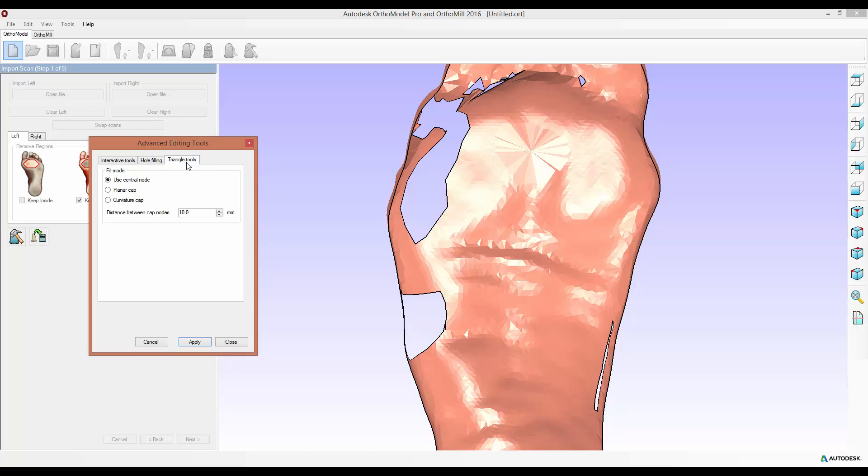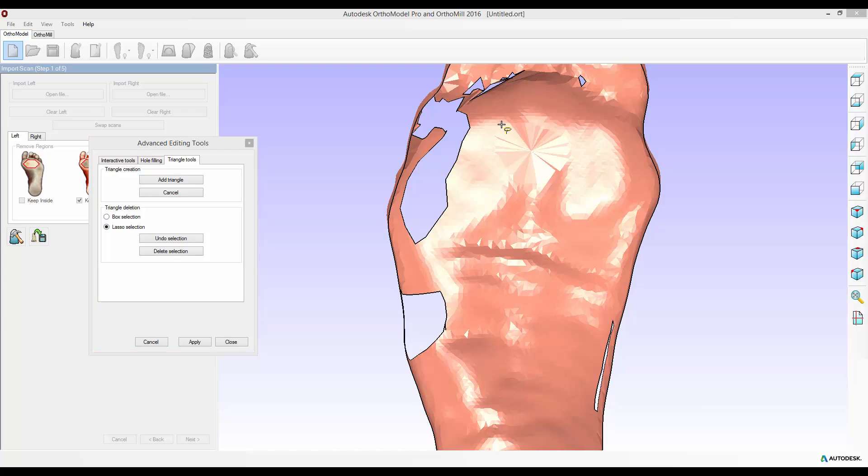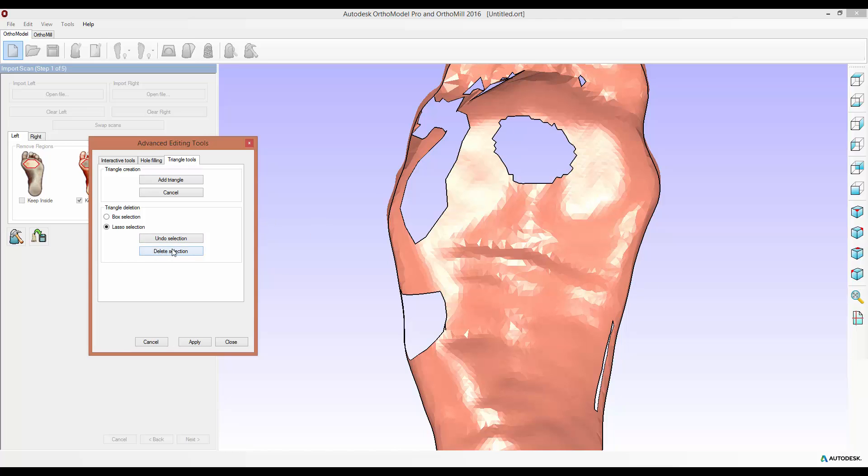I'll go back to the triangle tools, lasso select this region again. You'll see the triangles created using the central node method are quite large. I'll just delete my selection.